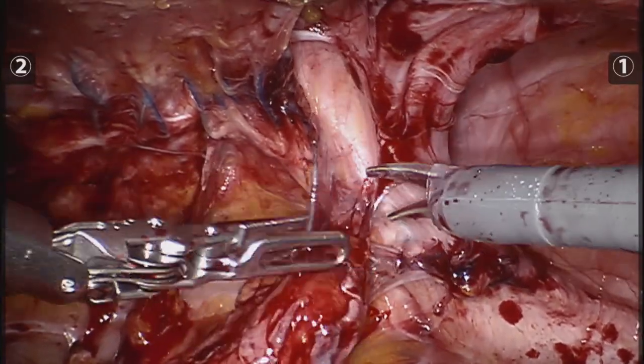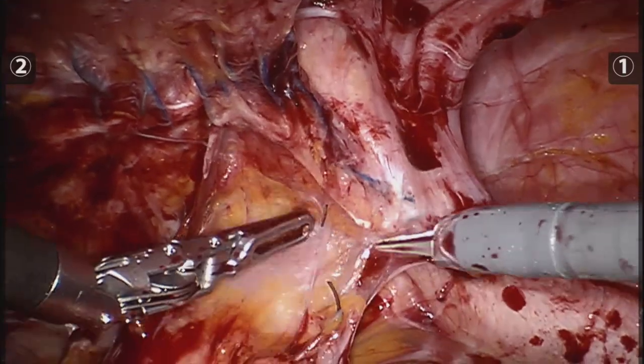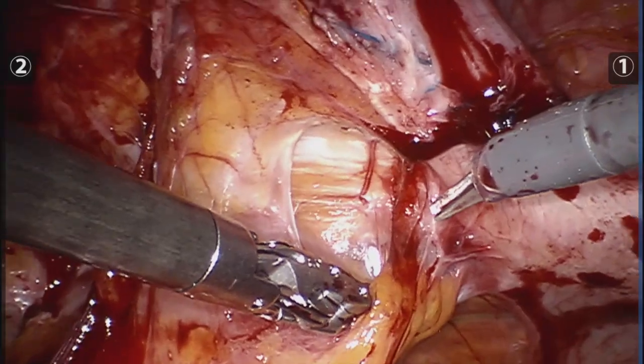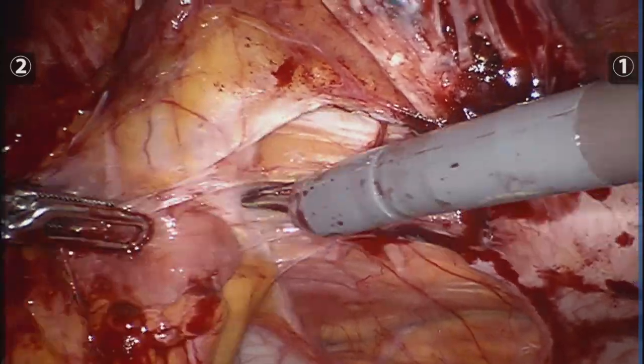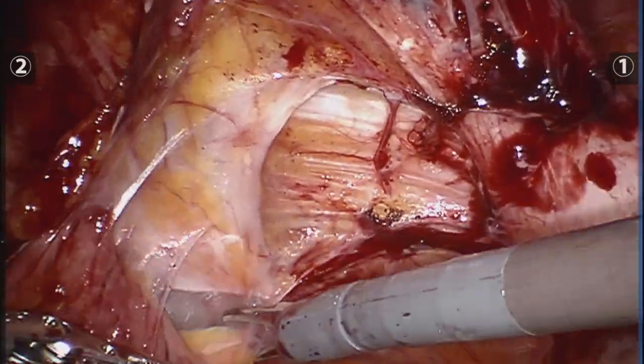Here we are being able to finally dissect some of the adhesions. This is the gap that divided the two defects but provided no strength whatsoever to the abdominal wall, therefore I took the defect as if it were one.